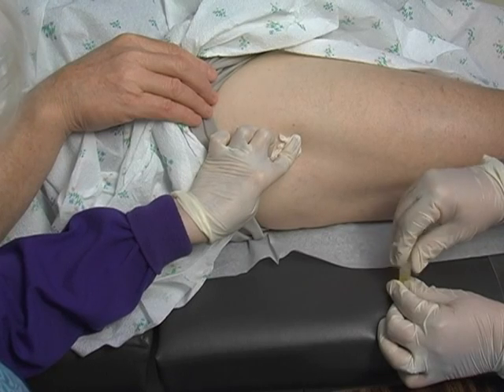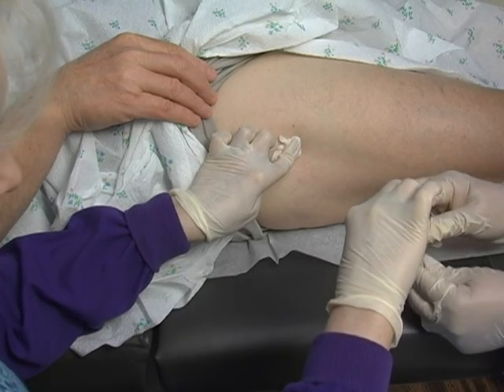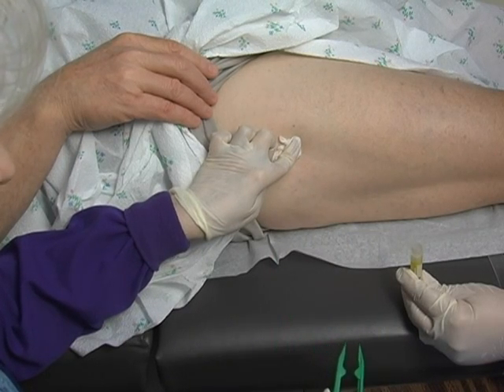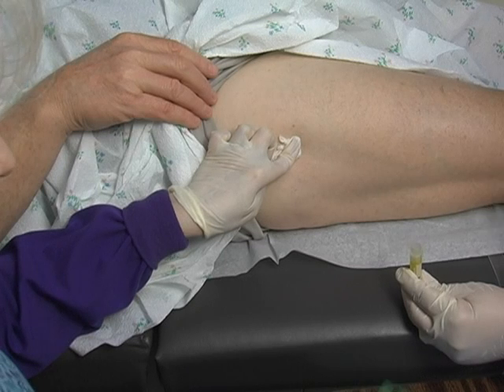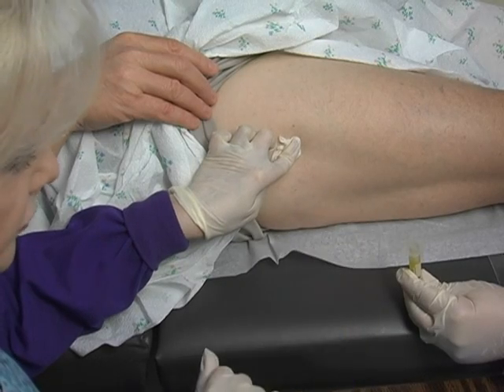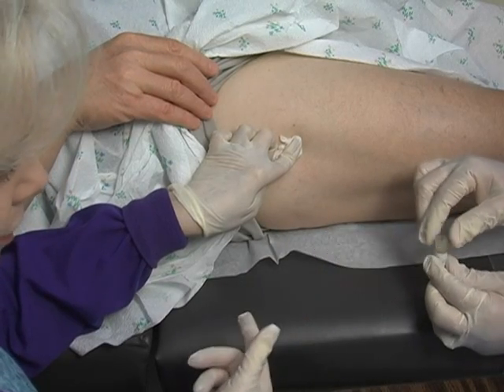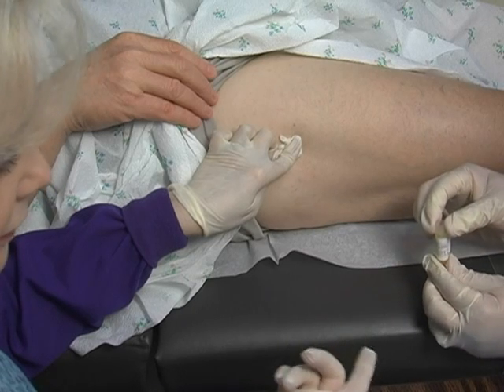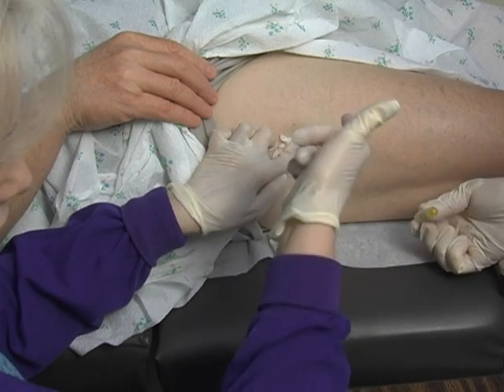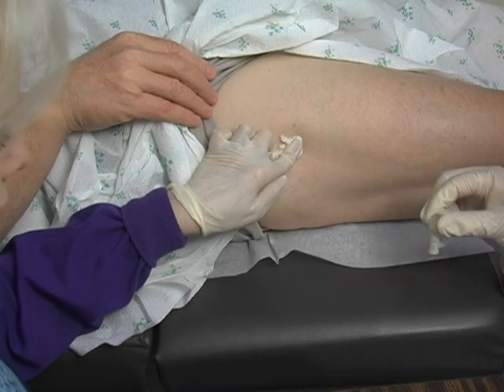If your plans are to do a second biopsy, be very careful that you don't stick your forceps into the zamboni and then use them for another specimen, because that does irritate the skin — so using the needle tends to help. Lynn was very careful when she placed the cap on not to crush the specimen. The zamboni is filled to the very top of those tubes so that the specimen doesn't air dry, and she gently rotated it so the specimen travels to the bottom and is fully saturated.